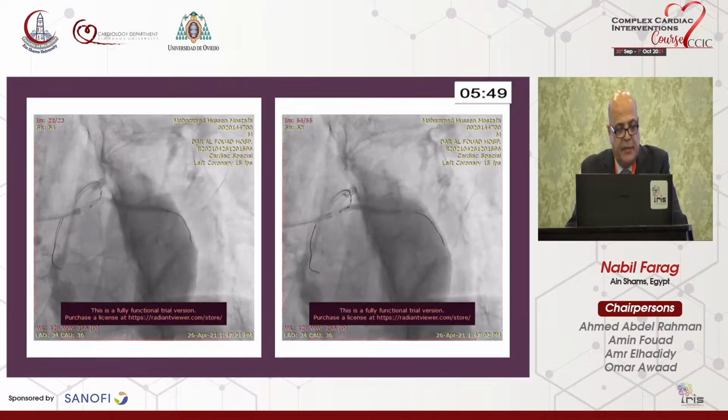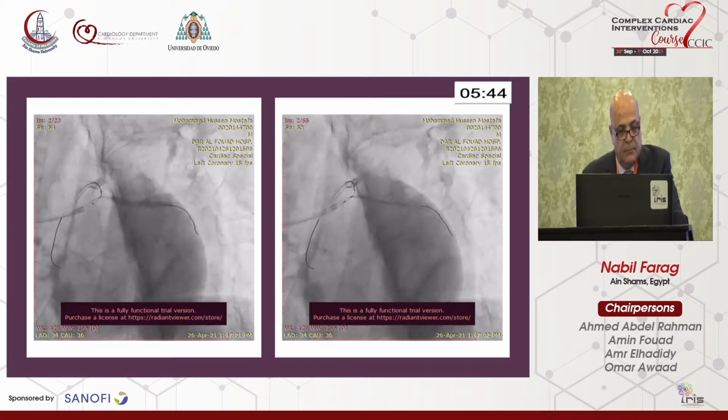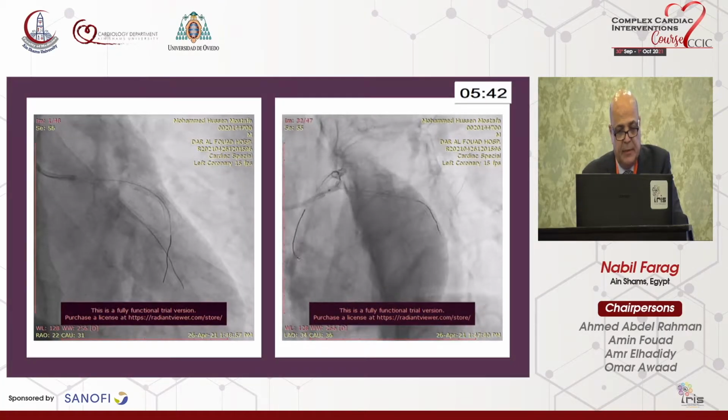And after that, we crushed the stent with the balloon in the left main LAD.